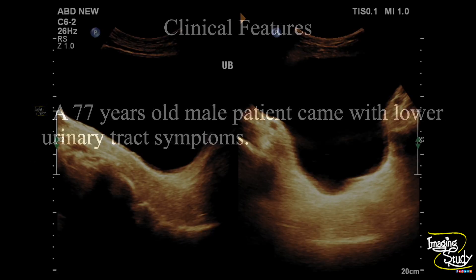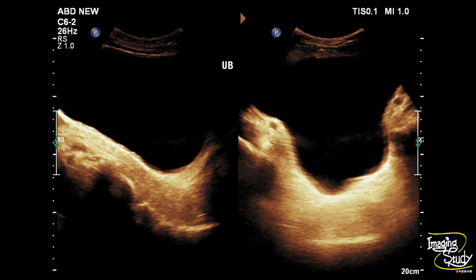Here you can see the urinary bladder in longitudinal and transverse sections. The bladder is well filled and the wall thickness apparently looks normal, but if you check the right image you can see there is a slight irregularity of the bladder wall which you may miss.